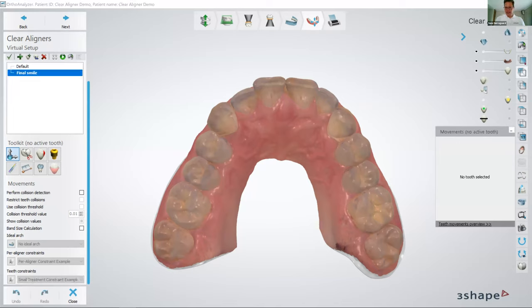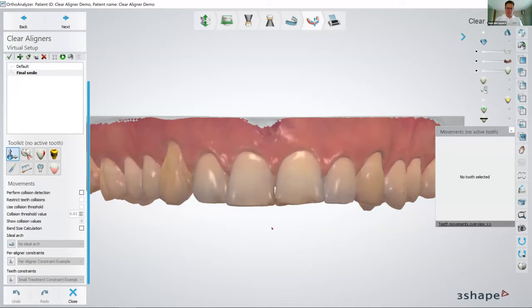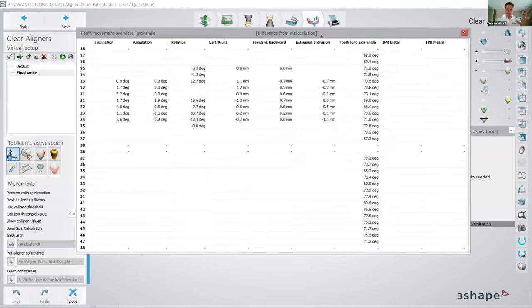So let's say that this is the smile that we are aiming for. We agreed with the patient that we have aligned the teeth and the arch shape and brought the canine in. Let's have a look at how the software can actually help us in order to create the clear aligners or the models for 3D printing. We do have a teeth movement overview that you can bring in. This is a full table of all the movements that have been going on. We only did movements in the upper, so we can see the different degrees: inclination, angulation, rotation, and so on. And then we can see the millimeters transferred into left and right, forward, backwards, and up and down, intrusion and extrusion.